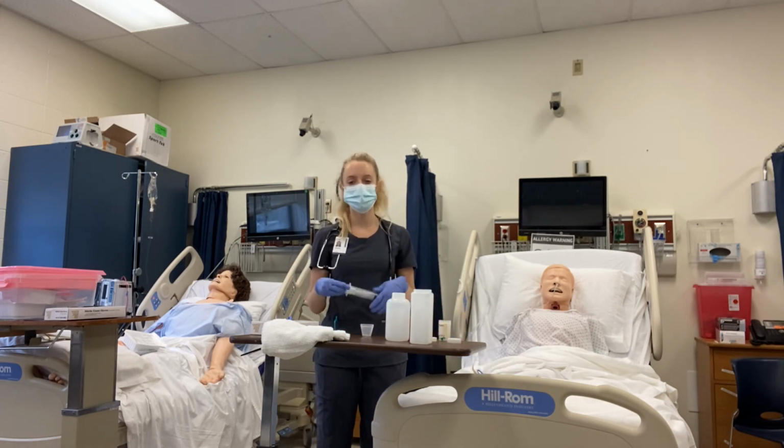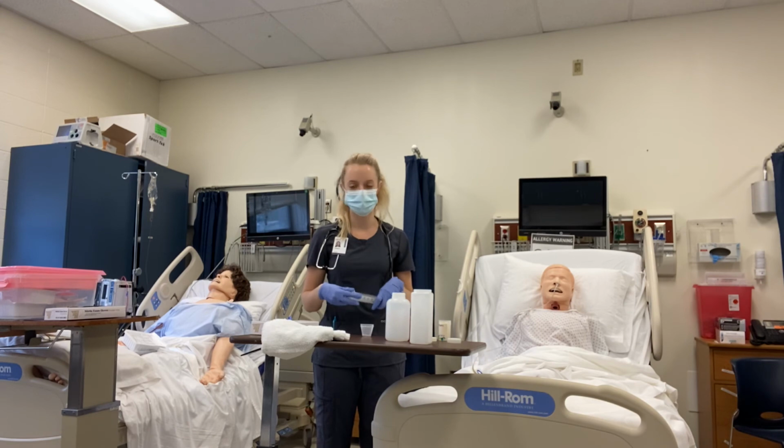You do not want to mix multiple meds and pass them through an NG tube at the same time. You want to do each med individually and make sure you flush in between each med.